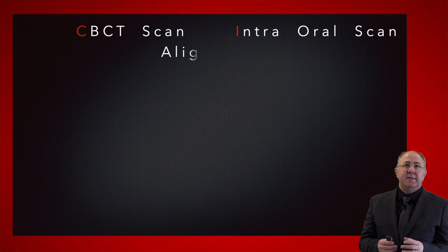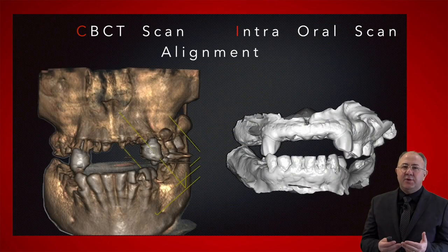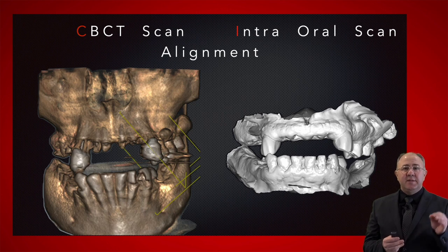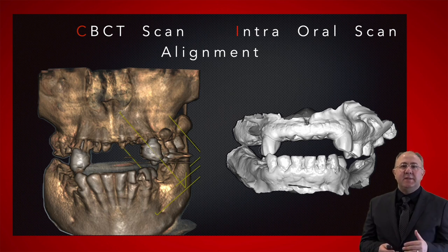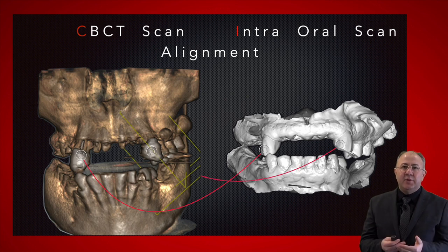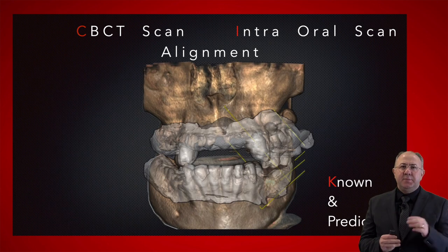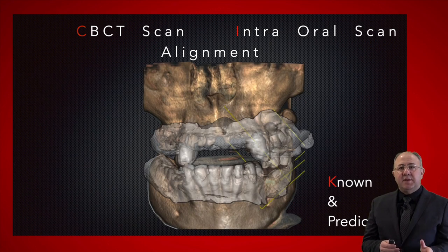The known method today to align an intraoral scan and a CBCT scan is very simple. You find reference points on teeth from both the CBCT scan and the intraoral scan, and the software will merge the two data together. The beauty of this process is that the software allows you to verify that the merge is accurate.